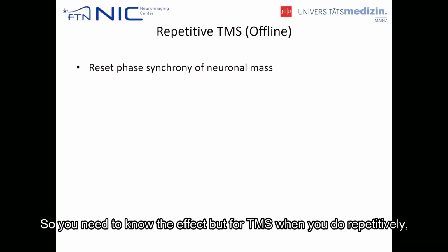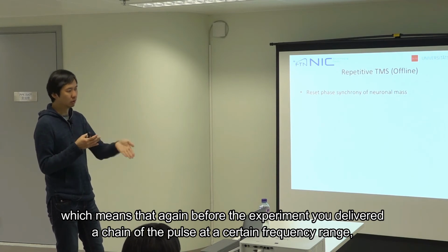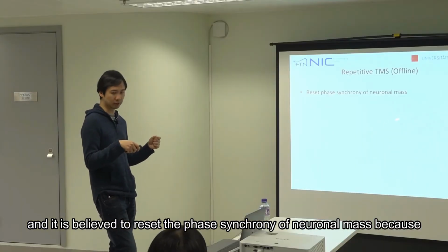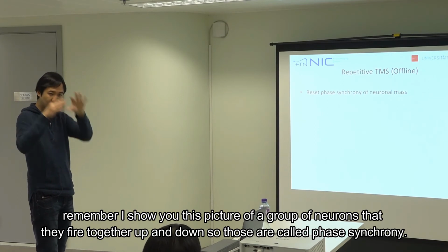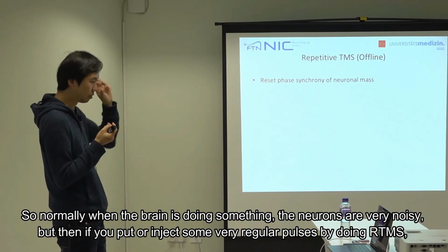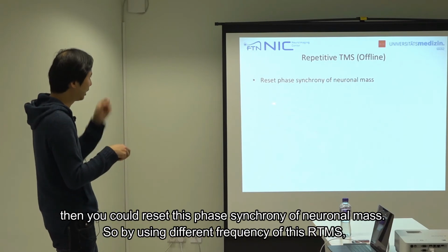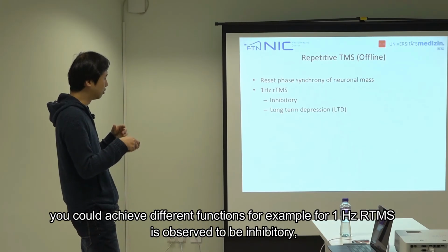So you need to know the effect duration. For TMS, when you do it repetitively, which means that before the experiments, you deliver a chain of pulses at a certain frequency range, it is believed to reset the phase synchrony of the neuronal mass. Remember, I showed you this picture of a group of neurons that fired together up and down. Those are called phase synchrony. Normally, when the brain is doing something, the neurons are very noisy. But if you inject some very regular pulses by doing rTMS, then you could reset this phase synchrony of the neuronal mass.